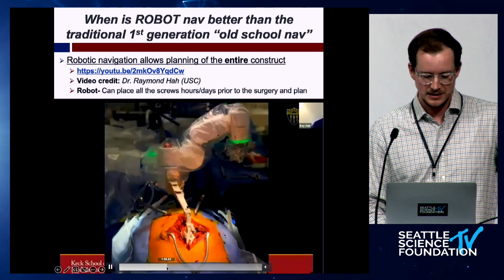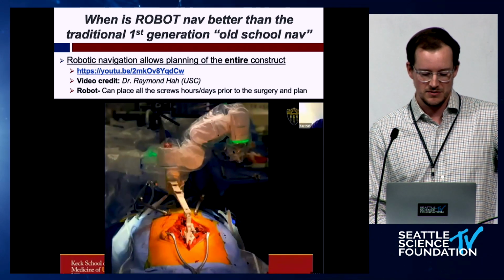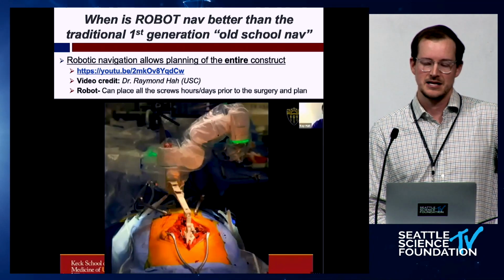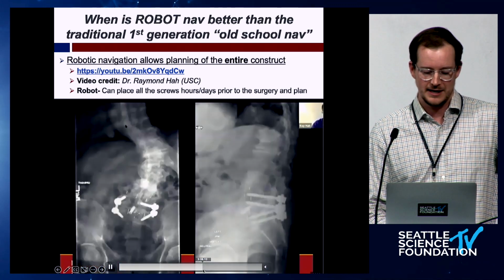He'll give another example where he's able to go in, and while that doesn't look as minimally invasive, it was the same thing Andrew was talking about earlier, where it's just cutting through the fascia in little strips. You still have your midline incision, but by doing that, it limits the amount of tissue disruption. That's just a whole nice goal.